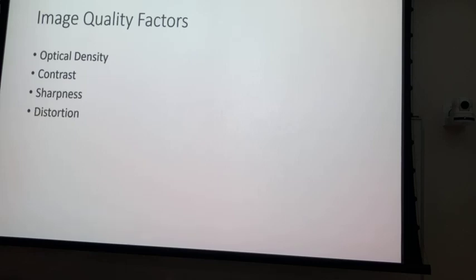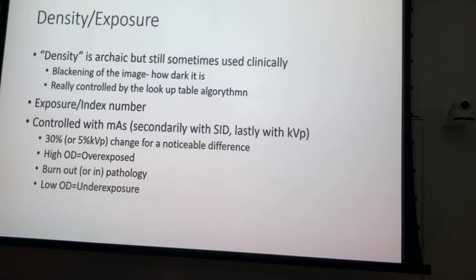It's the technique as it interacts inside of the patient and gives us a remnant beam that affects the exposure at the image receptor and gives us these four things. So that's kind of an introduction to the rest of the semester. And there's enough bleed over between each of the chapters that it's worth talking about them on each one of these.